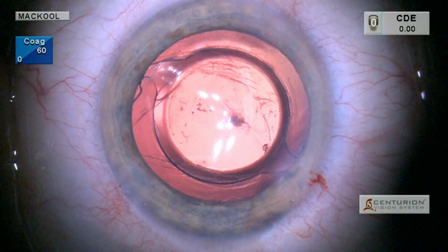This patient has undergone previous cataract implant surgery with implantation of the intraocular lens into the capsular sac, and as can be seen here, a fairly wide YAG laser posterior capsulotomy. The problem is that the patient has very, very significant negative dysphotopsia. So the plan here is to free the optic from its attachments to the capsule and prolapse it anterior to the anterior capsule, so-called reverse optic capture.